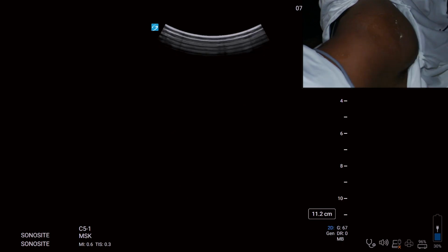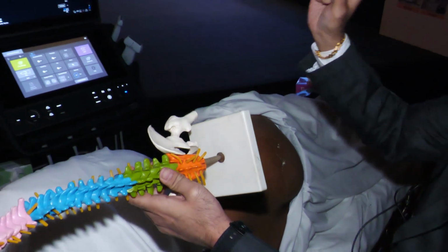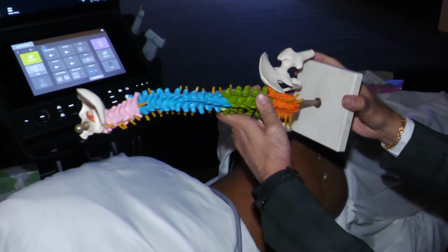So up till now, I have told you 3 approaches to sacral plexus. The parasacral parallel shift, can we have this as a bigger screen? Again, I'll explain. Then the Taha's approach, and the parasacral ischial plane block. So again, I'll explain till the time they are on.